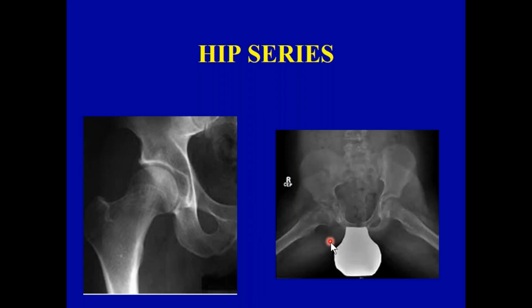So your answer to this is still the underwear line, and then you simply have the patient cross their leg, figure 4, either in front of or behind them, and they hold on to the sides of the bucky just to stabilize themselves. Or if you don't like that, you can have them put their foot up on the chair, and if the body is at right angles to the hip, you're still aiming at the same point, the underwear line or the inguinal crease.